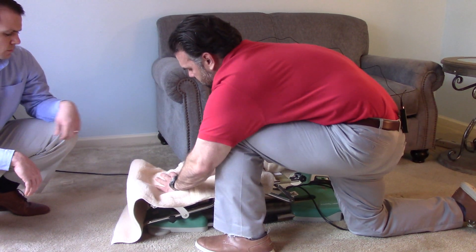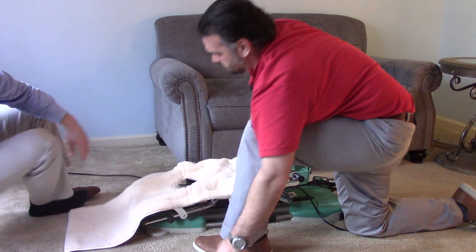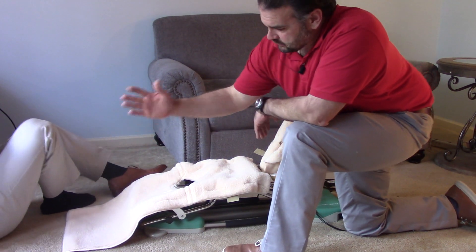As far as putting this cover on — so that's just the tail. If you're really tall, you might use up all of the tail.